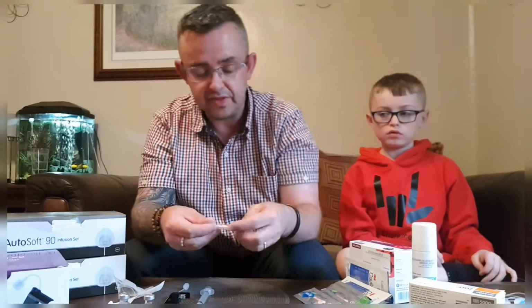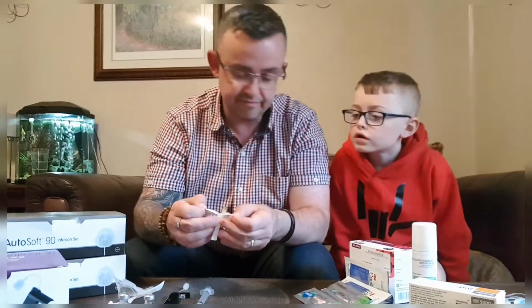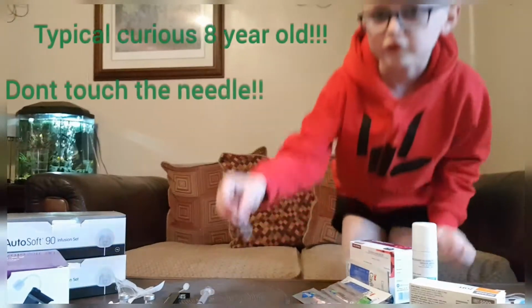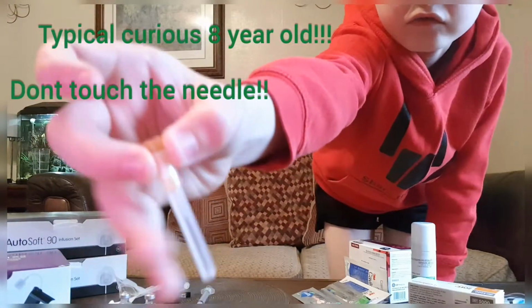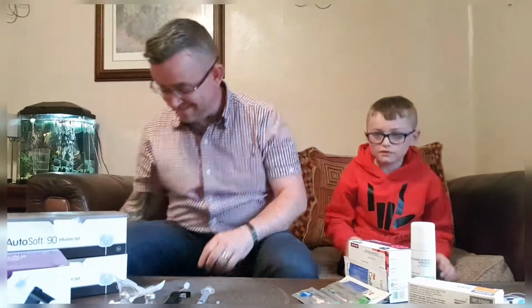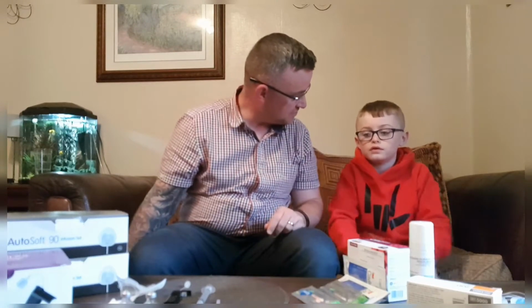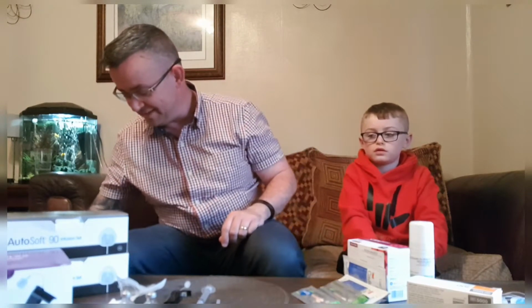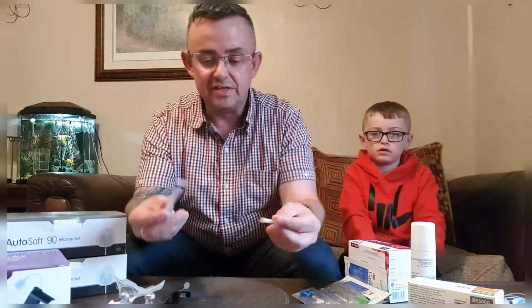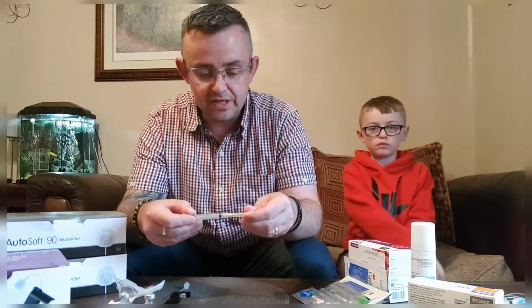They're brilliant. Right, this is a sharp needle, so you mustn't touch this, okay? It's a big one. So I've just said that's a sharp needle, you mustn't touch it, but you've shown the viewers. It had its protective cover on it anyway. So, syringe, needle. That twists on there.